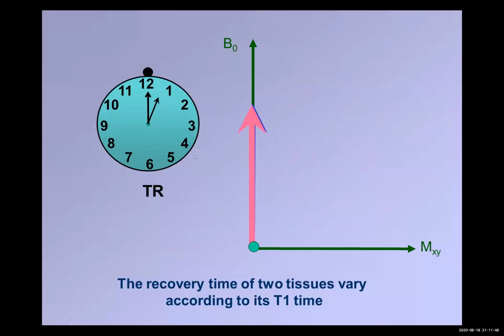For example, say I have two runners. One is fast and one slow. I say I will go 5 minutes and then come back. When I come back, I'll see who reached the line. When I come after 5 minutes, I will find them both already reached the final line. But if I come after 30 seconds or 20 seconds, I will be able to see which one is faster.